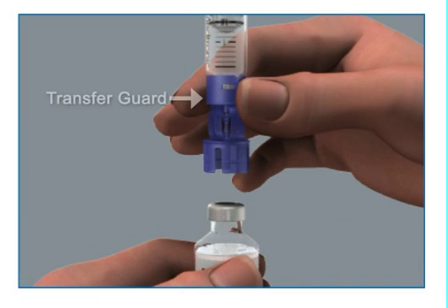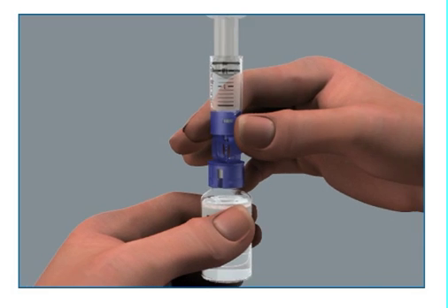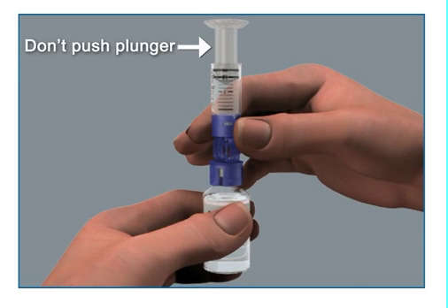Hold the reservoir by the blue transfer guard and connect it to the insulin vial by pressing down. Be careful not to push down on the plunger during this step.